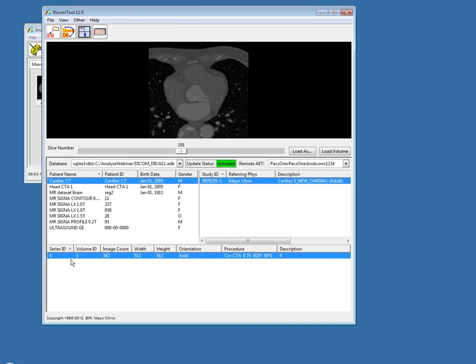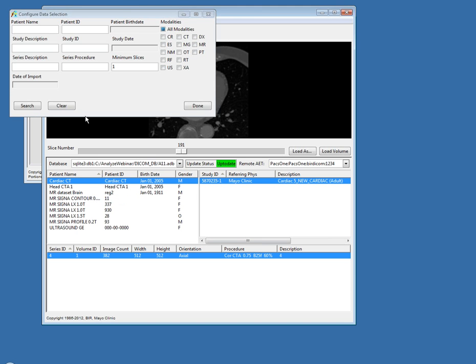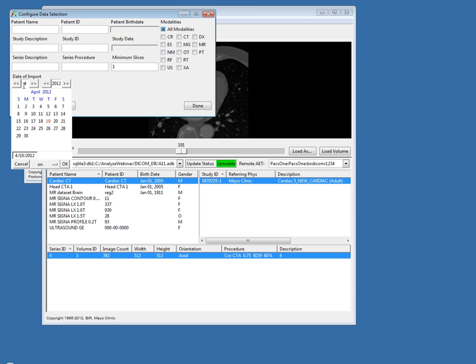Another new option in the DICOM tool is the ability to filter which data sets are displayed in this window based on their date of import. Often I get a large number of data sets in my database, import a new one, and can't figure out where it's located. One way to address that is to right-click and choose Configure Search. This Configure Search window now has a date of import option. You can filter files imported on a specific date, before a specific date, after, or between dates.